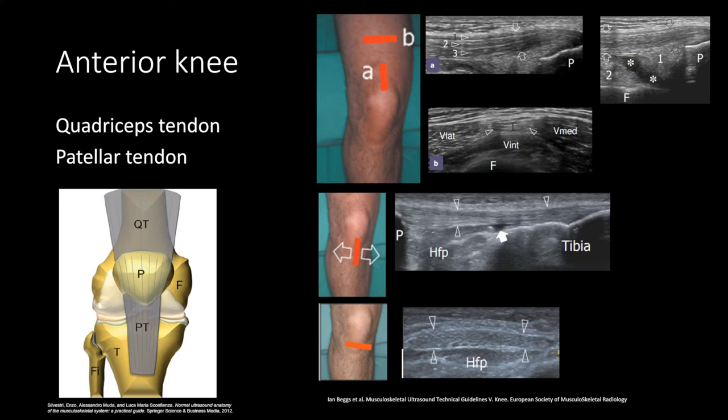The empty arrowheads show the patellar tendon from the patella to the tibial tuberosity. The arrow is the deep infrapatellar bursa, and it is normal to have some mild distension of the bursa here. Hoffa's fat pad is labeled as HFP.